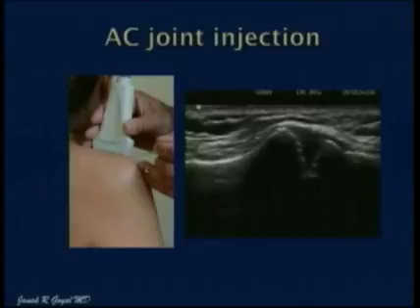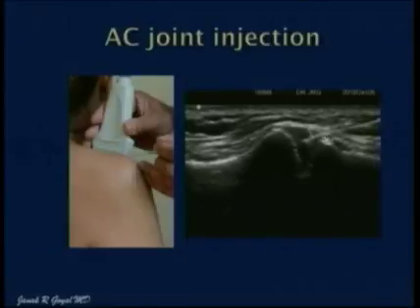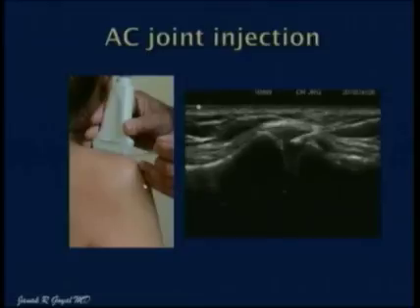AC joint injection. I proceed from lateral to medial, in-plane approach. Here is the needle going from lateral to medial with an in-plane approach and injecting.